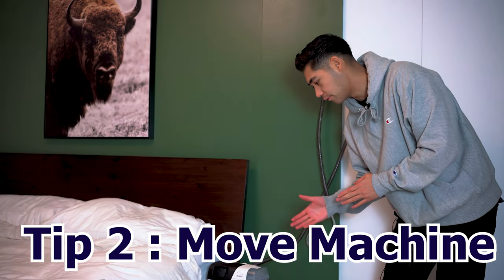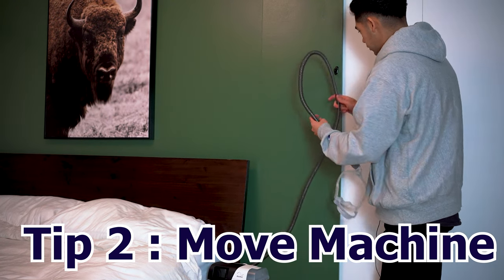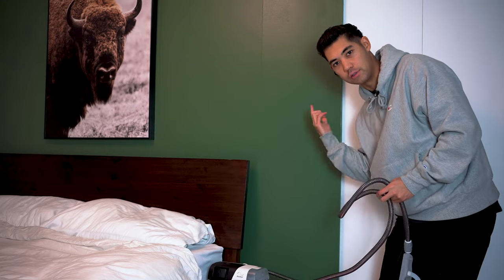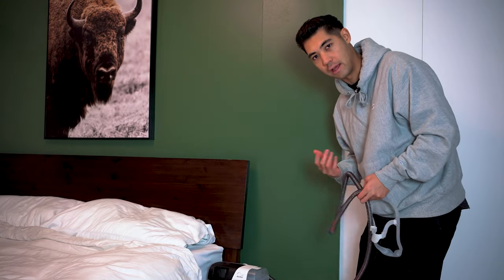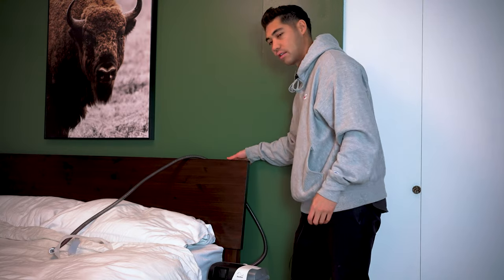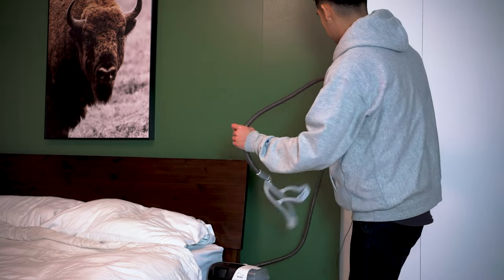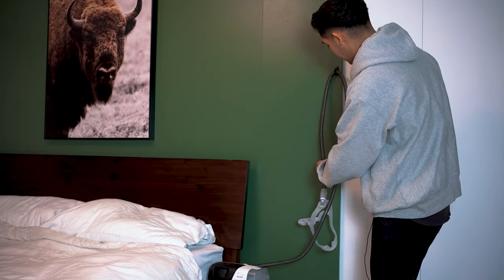That brings us to tip number two: moving your machine. Here we have the machine and a tube hook. You can use a tube hook attached to your bed to hold the tube in place, or you can use something on your bed frame to keep the tube elevated.